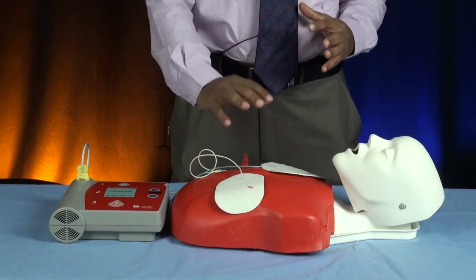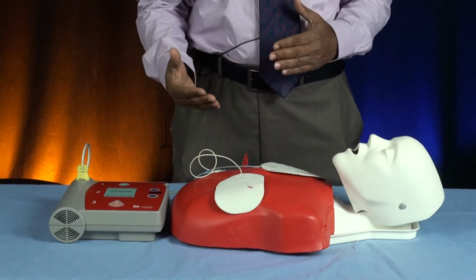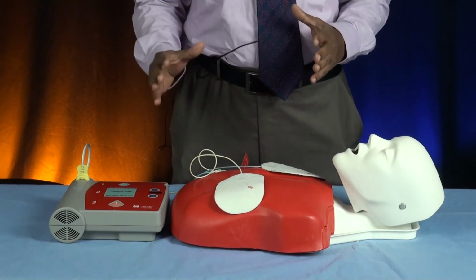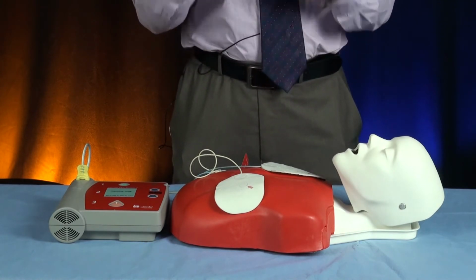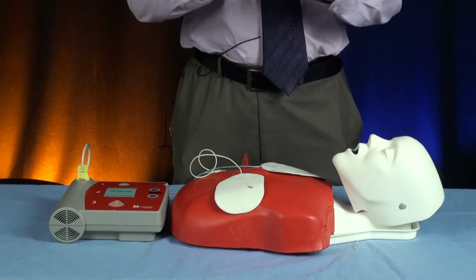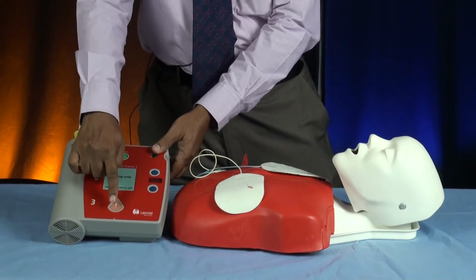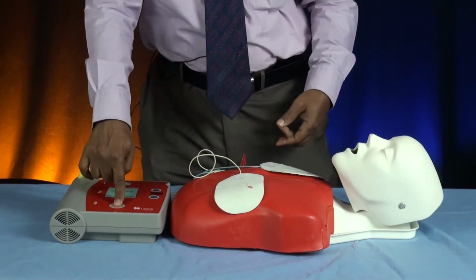Third step, you need to analyze the situation, whether the victim needs a shock or not. The machine itself will give you a message after analysis. If the message from the machine tells you to deliver shock, or shock advised, you should clear the victim by saying, I am clear, you are clear, we are clear, and then shock the victim by pressing this button. After the machine becomes ready, it will light up, and you press it to shock.